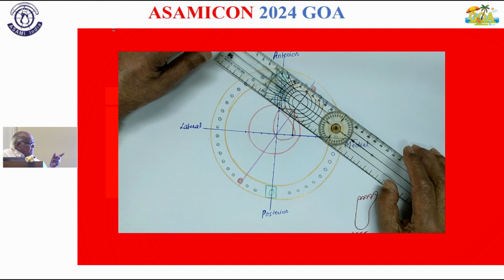So that you get those two holes for putting your rod of the hinges. And you get the posterolateral third hole for the distraction rod.